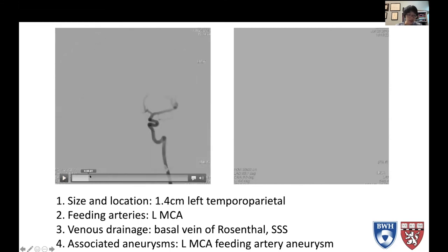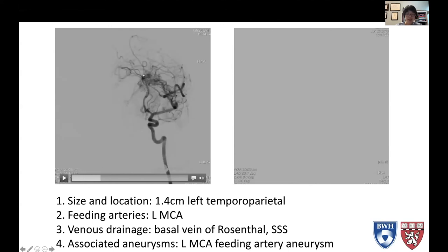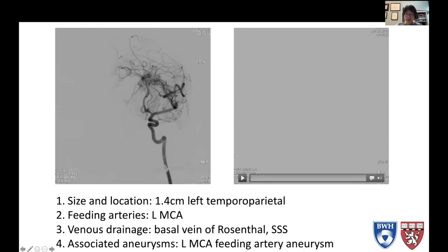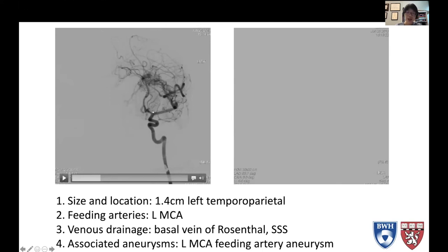This is a left internal carotid artery injection. You can see this tangle of vessels — the AVM arising in the arterial phase of this angiogram. This is the middle cerebral artery. These vessels are very large; usually by the time you get this distal, vessels become very small. This is because of the high flow to the AVM. You will often see very large intracranial vessels that are feeding arteries to the AVM.